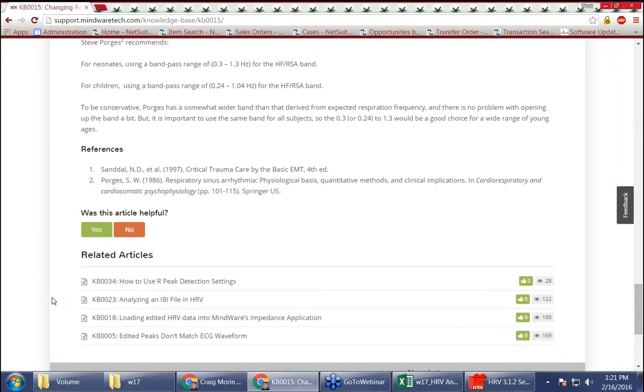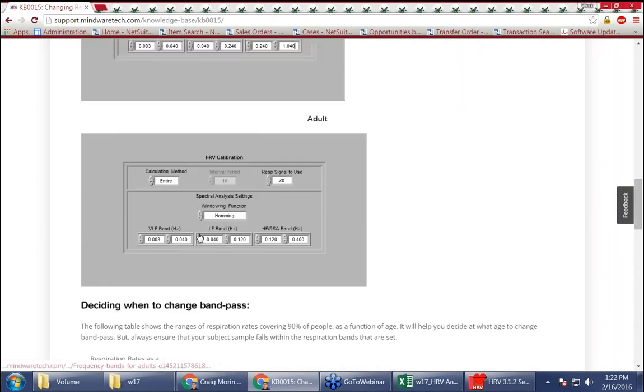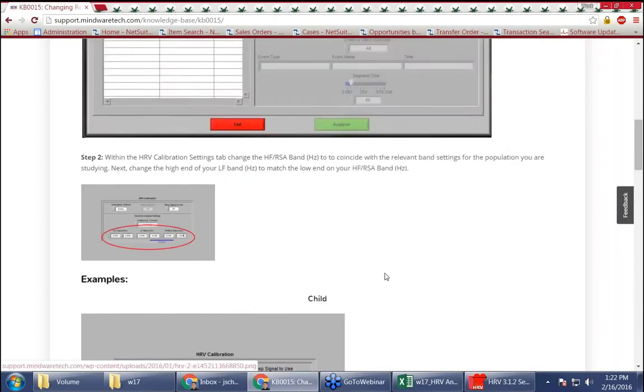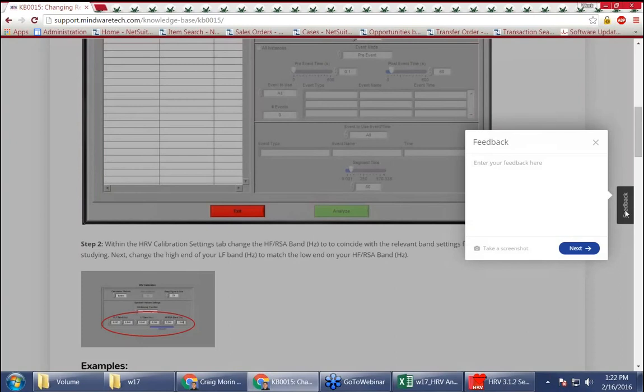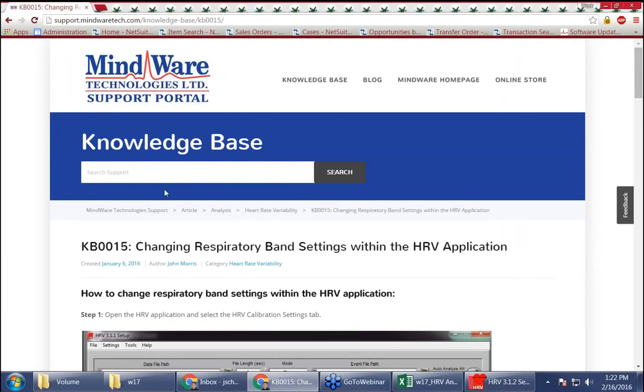I know that sometimes people kind of gloss over those because they don't think it will actually help, but we are monitoring these pretty closely. So if you feel like there's anything that could be added, or something that still had you scratching your head, please go ahead and say what could be improved, and we'll work on that. We also have the feedback option right here, where you can very quickly put in what you thought about the article. So that's basically the down and dirty on how that works.